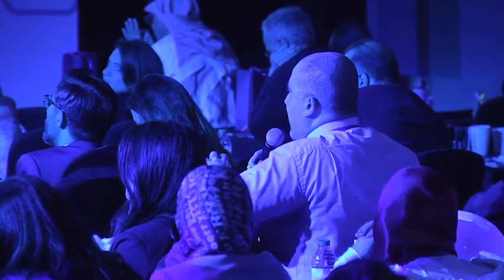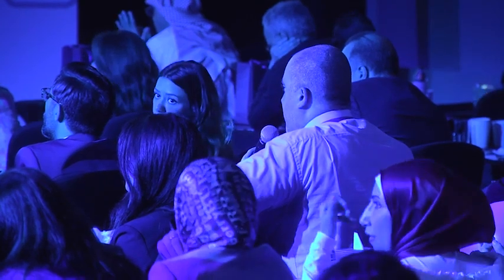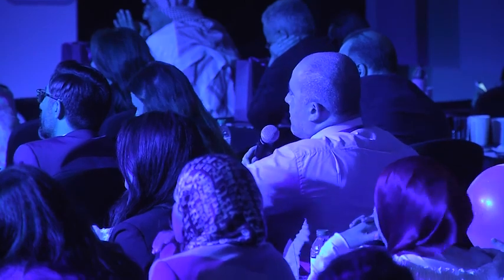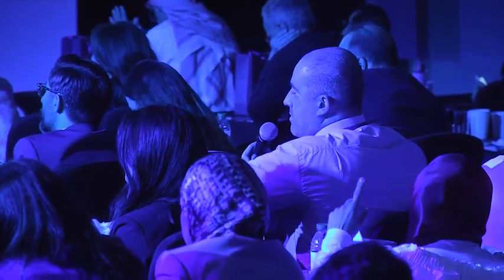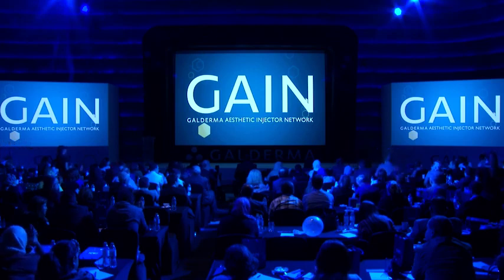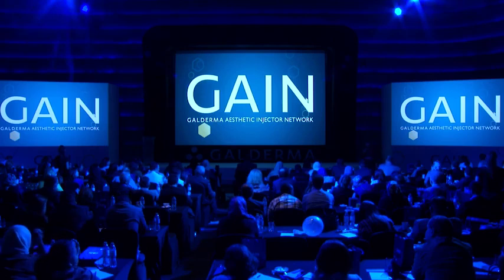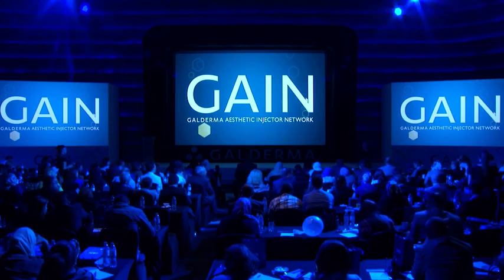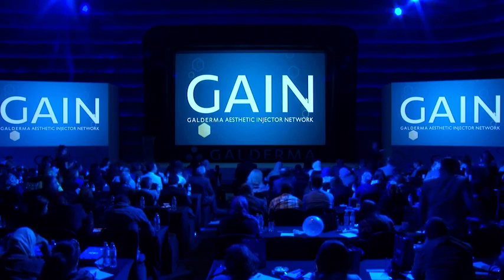So we are now changing the idea about the volumizing. So if this patient was a male, what are you going to do for the cheek? Sorry, I don't hear the people. No problem. So he was asking that if the patient you're treating just now was a male, would that differ in the decision of what product to use to volumize?